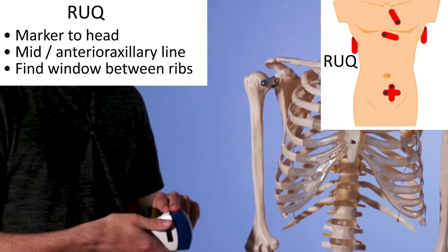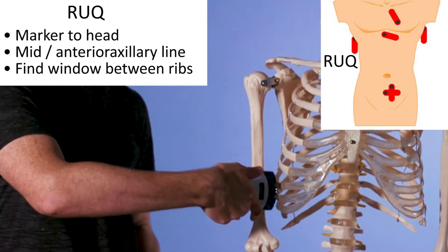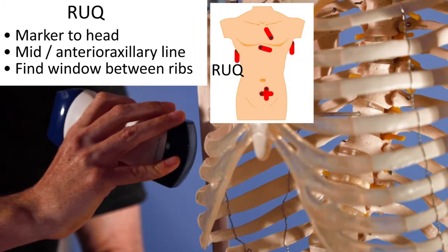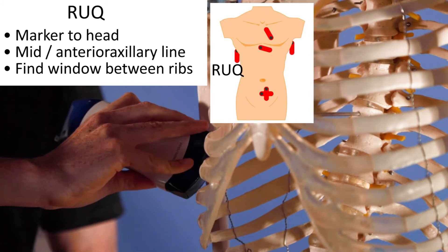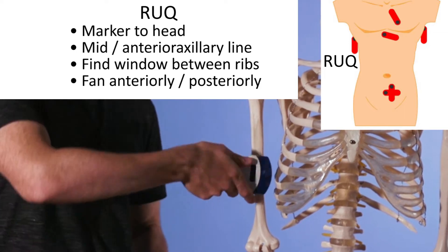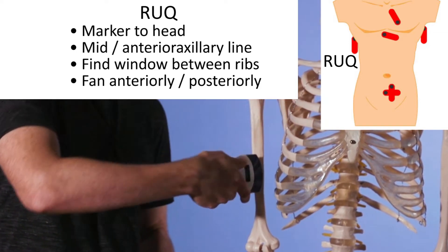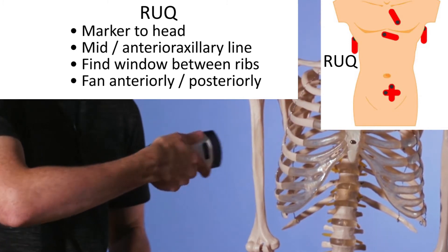For the right upper quadrant, have the probe marker to the patient's head. Place the probe in the mid to anterior axillary line and find a window between the ribs. You may need to slightly rotate the probe so it's more parallel to the ribs to get rid of any rib shadows. Then once you've found your window, fan the probe anteriorly and posteriorly, keeping the footprint planted and moving the back of the probe anteriorly and posteriorly, beaming through the whole region.